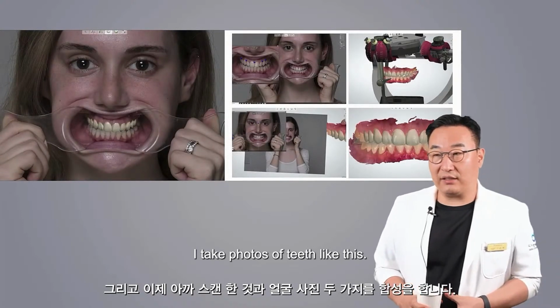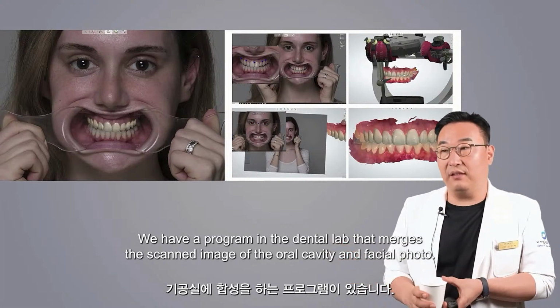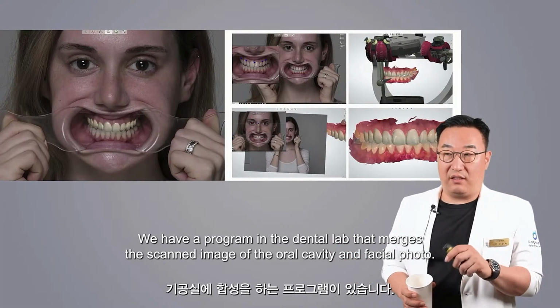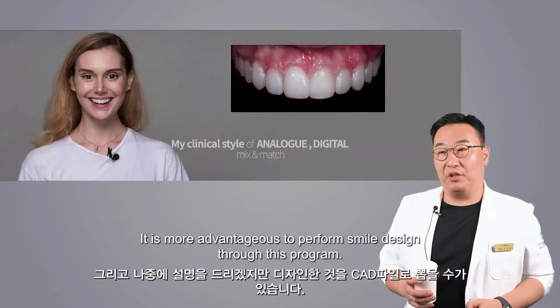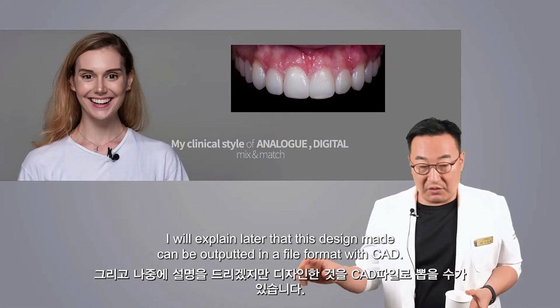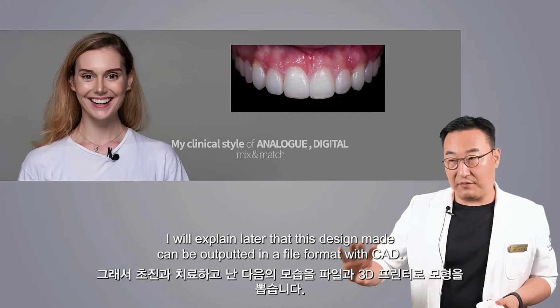Then, we have a program in the dental lab that merges the scanned image of the oral cavity and the facial photo. It is more advantageous to perform smile design through this program. I will explain later that this design can be outputted in a file format with CAD.